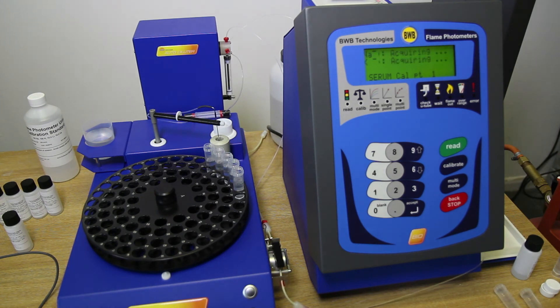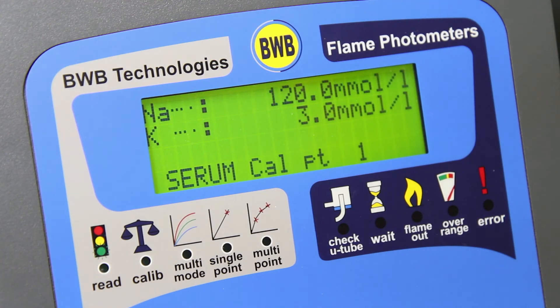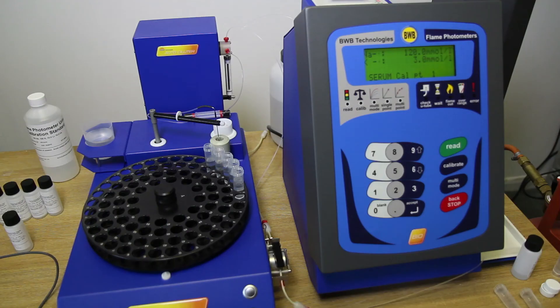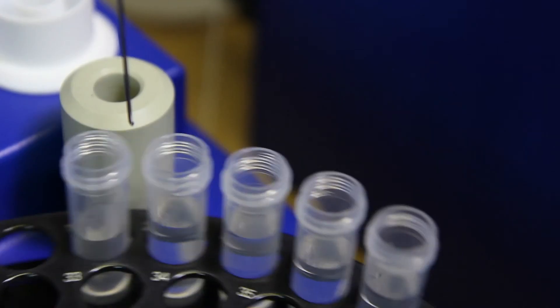The BWB Bio will take a reading once it has acquired a stable signal. Once the reading has been acquired, the AFHS will flush the sample using fluid from the reservoir and automatically position the carousel for the next reading.